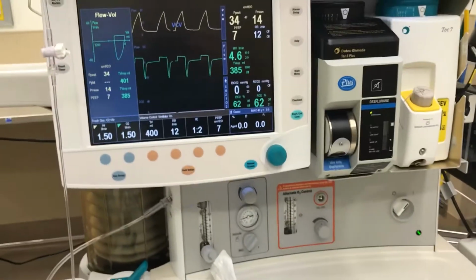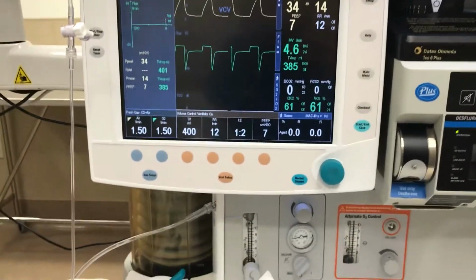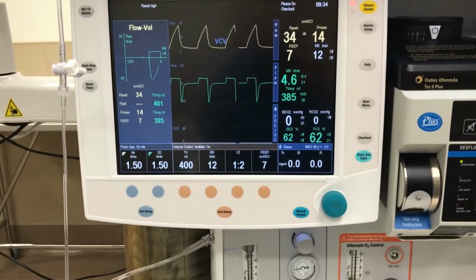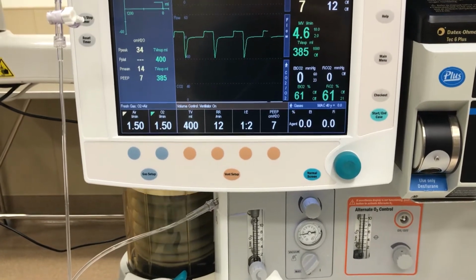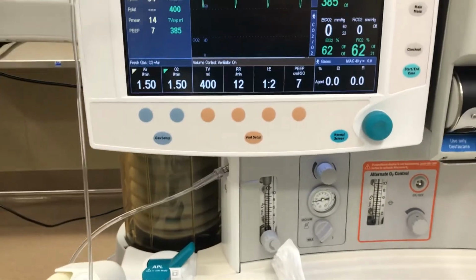If we have to use one of these machines, the CRNA will do the checkout, and we will be in the building to help with the management of them, just because of the unique characteristics.